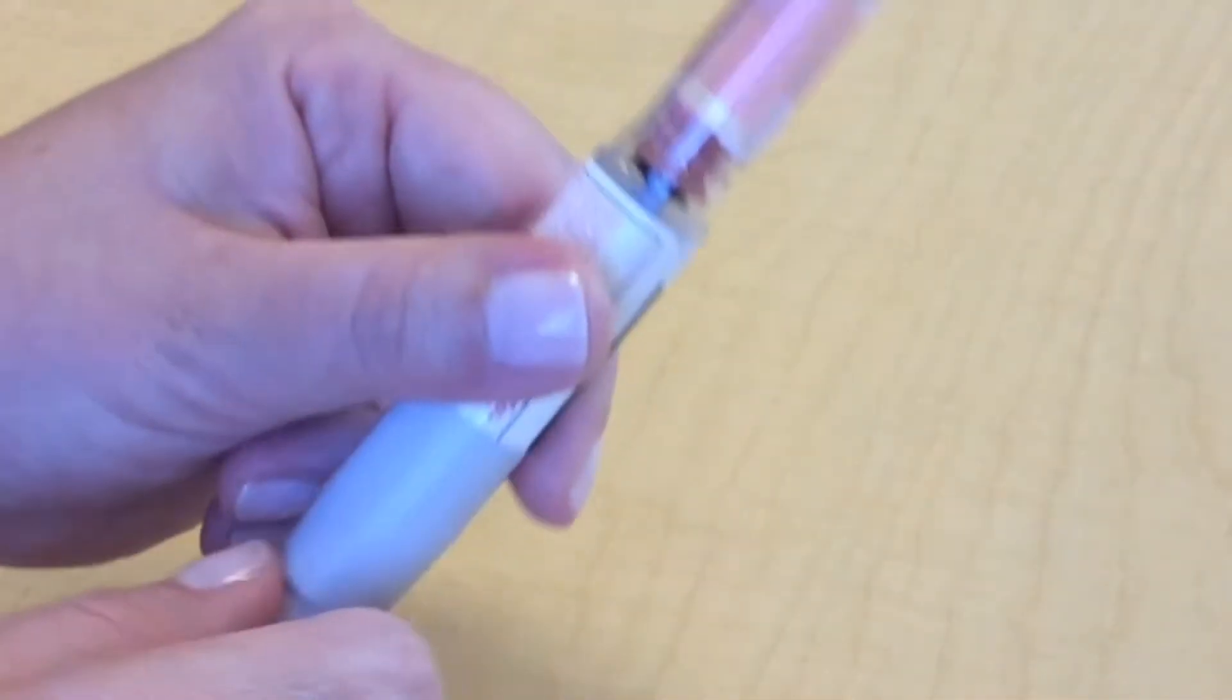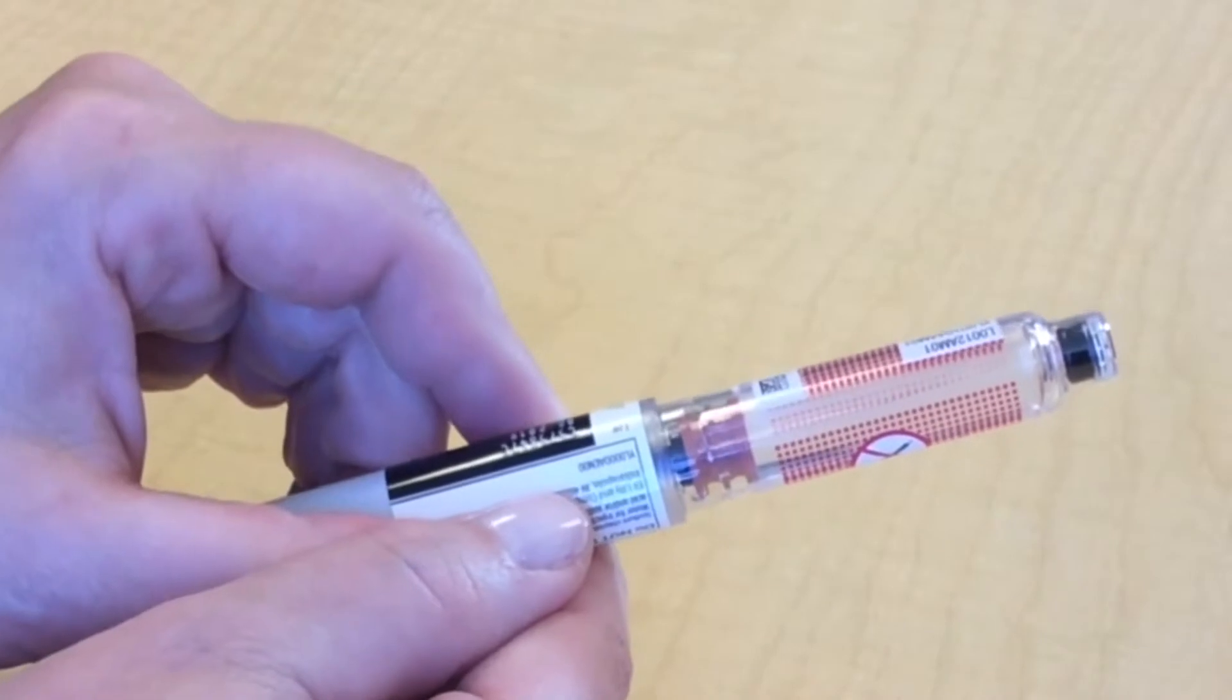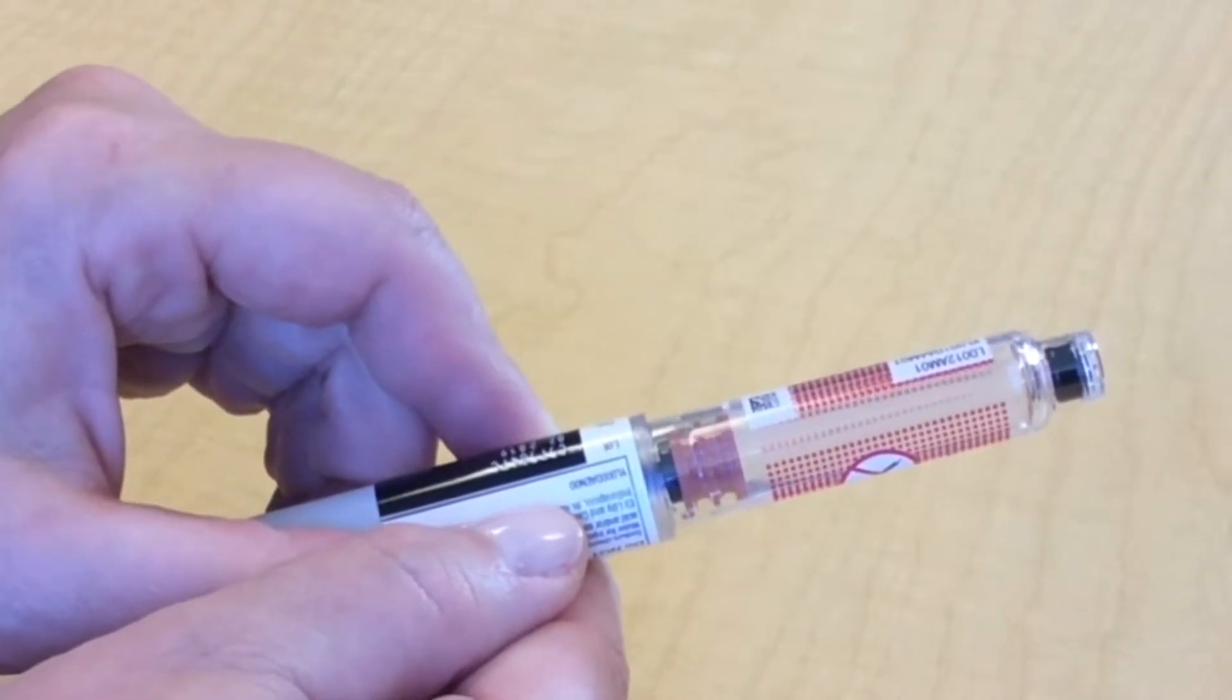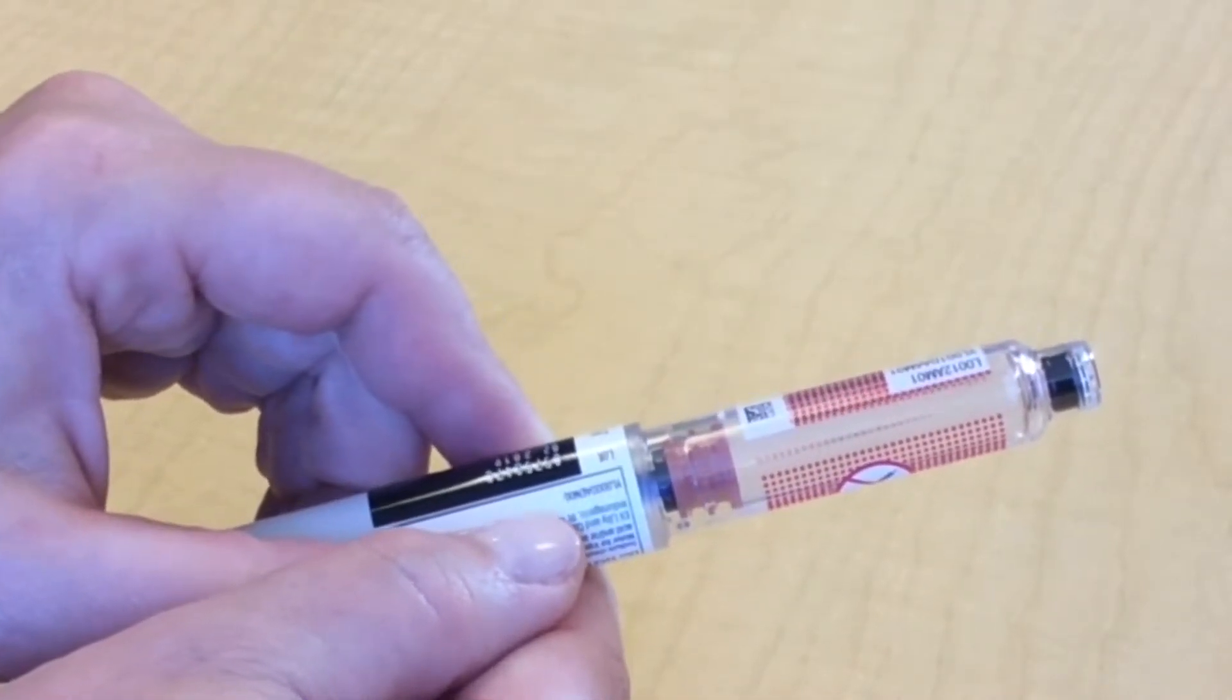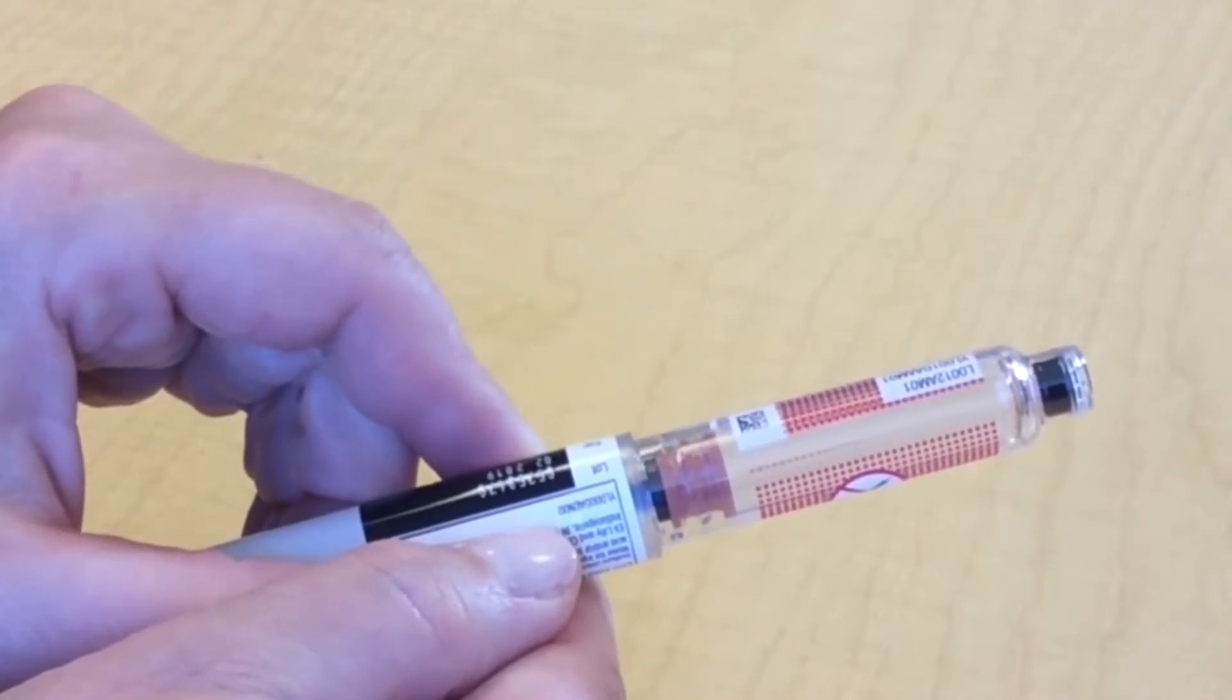Now, inspect your insulin by looking at the insulin. Make sure you know what your insulin should look like. If you're unsure, talk to your healthcare provider, certified diabetes educator, pharmacist, or check the package insert to find out.